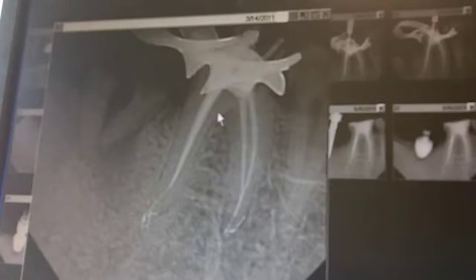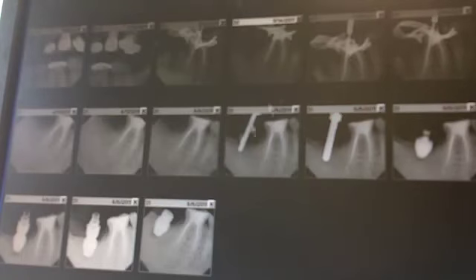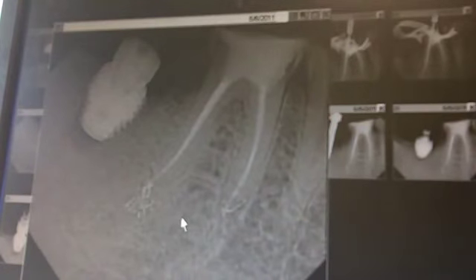So what we have here is a patient that came in, had a lot of decay, a tooth that had the top part of it pretty much missing. All he had was infected root tips in his jawbone, and we were able to, at this office, do the root canal, extract the root tips, and actually place the implant. The patient didn't have to go to any other offices. The patient was sedated. All the appointments were pretty fast, efficient. We were able to do everything here in the office, from the root canals, making the crowns, to placing the implant.